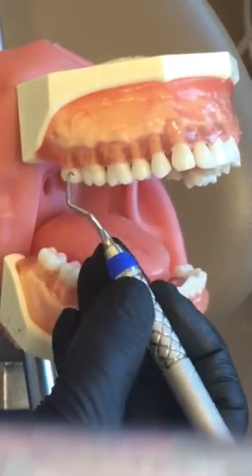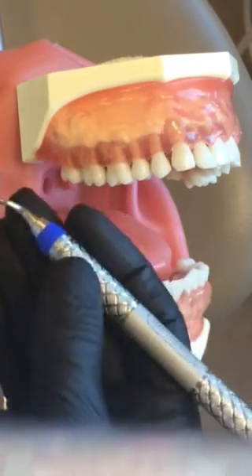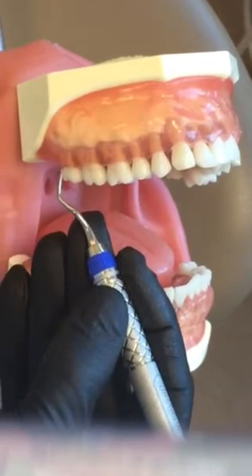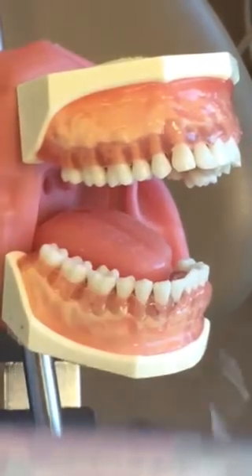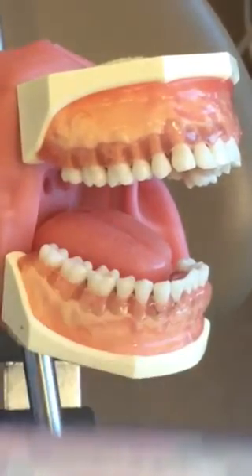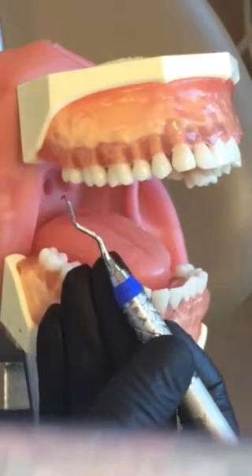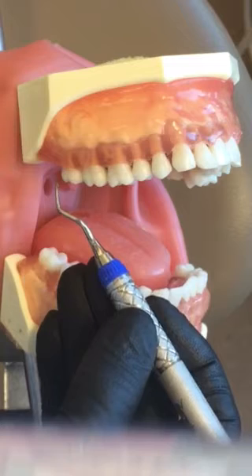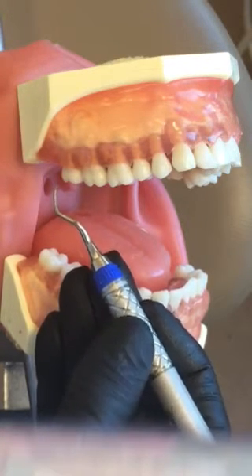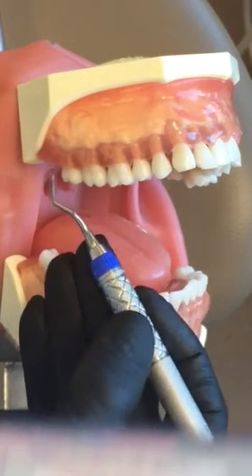I'm going to be working on the maxillary buccals of 1, 2, 3, 4, and 5. So I'm going to establish where I would fulcrum and look at my terminal shank to see which end is parallel. I see this end is going to lay across the tooth and this end is perfectly parallel. I would be retracting the cheek with my mirror, have my patient close about halfway down. Patient is in a maxillary position and I'm at 8 or 9 o'clock since this is an area towards me.